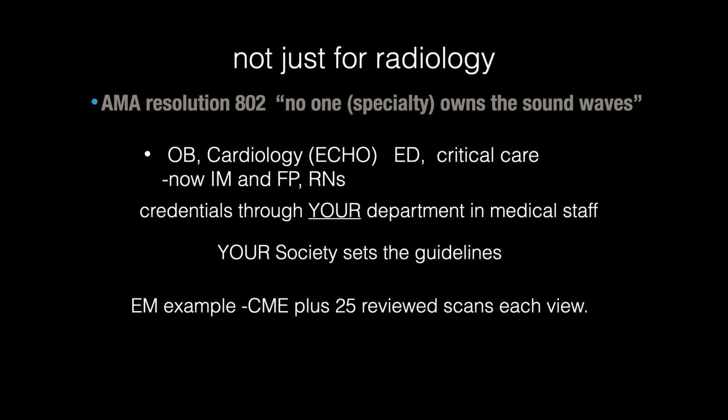For example, emergency medicine insists on having 25 overread scans of each view you do before you're approved, and also about 25 to 30 hours of ultrasound training before you can use this clinically.